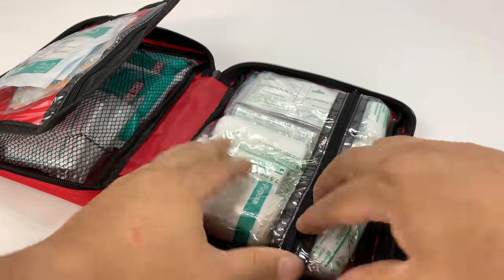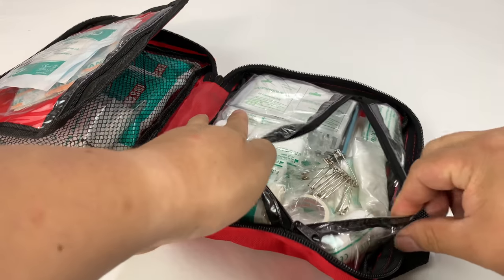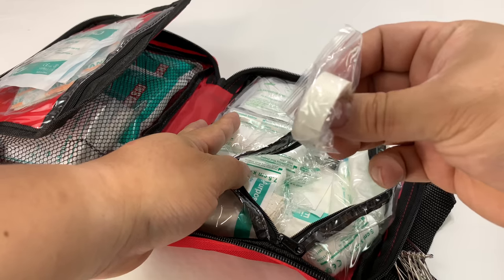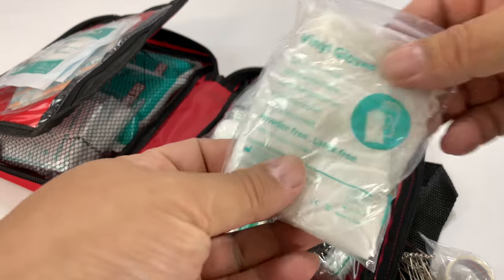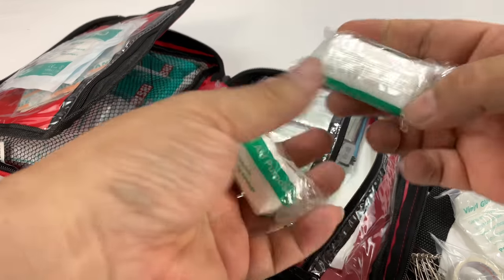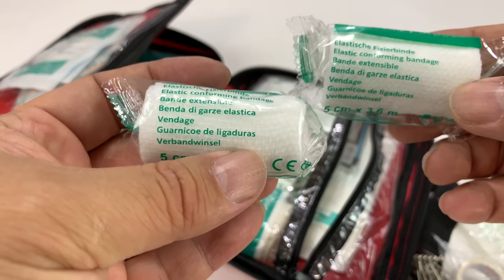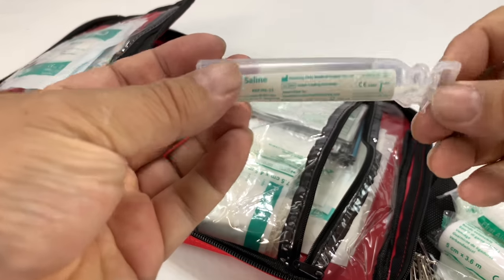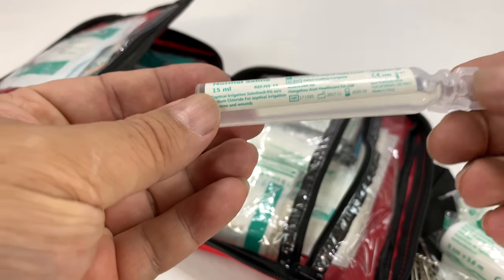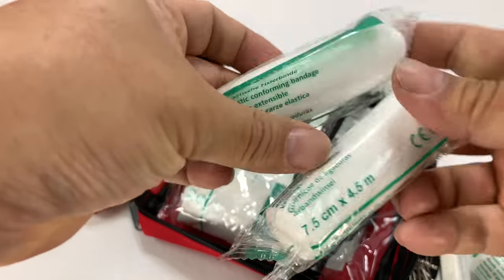On this side we have another clear pouch, and this one is just chock full of stuff. Safety pins, looks like we have some bandage tape, and we have vinyl gloves — keep yourself safe, keep the first aid safe. Elastic conforming bandages, so those are things you can wrap up nice and tight. Saline, gives something a nice washout. And then more elastic bandages.